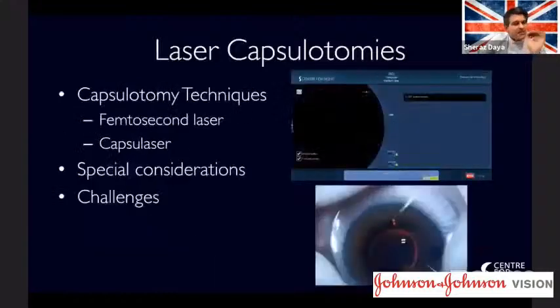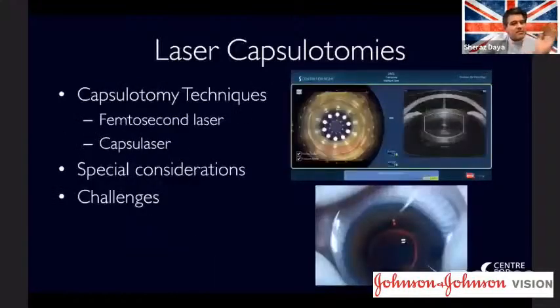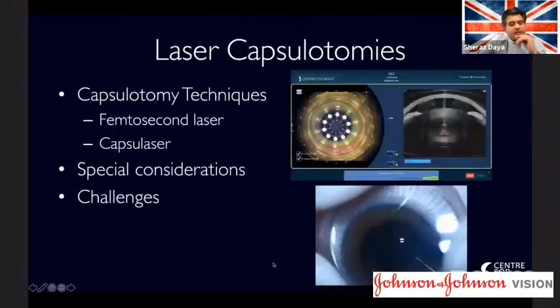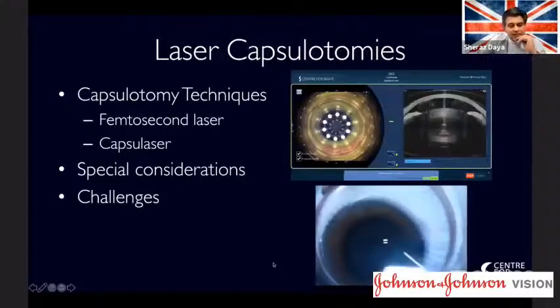I'm going to be talking a little bit about two techniques, one femtosecond laser, and the other is capsule laser as well, which uses a dye staining on the capsule and performs a capsulotomy. And we call this selective laser capsulotomy.